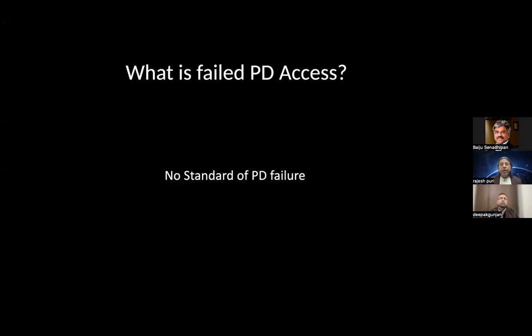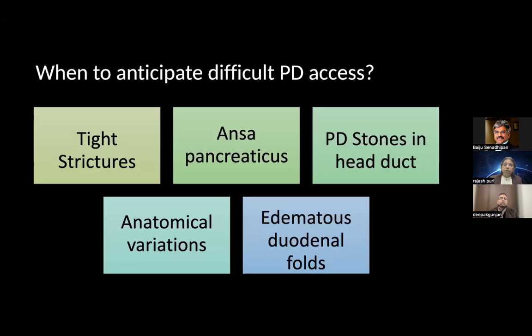But generally, if you are not able to succeed in the pancreatic duct cannulation, my suggestion, rather than fiddling with the pancreatic ampulla, is that it is better to call your senior or expert, or refer the patient to a place where more pancreatic endotherapy is going on.